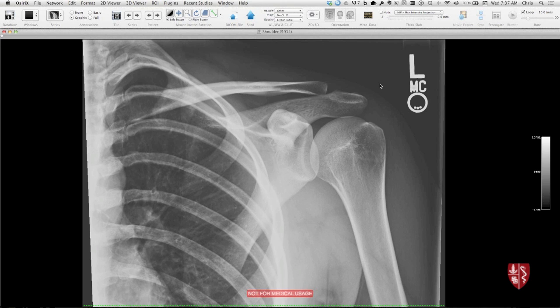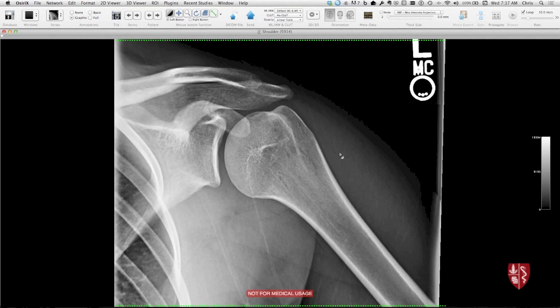And then as we go along I'll try to ask for some of the audience input. Just remember you have the scapula with the glenoid fossa, humeral head, clavicle, acromioclavicular joint, and then the acromion here. And this process that's coming out here is the coracoid. This would be just a straight AP view. And remember on the AP view you should have overlap between the humeral head and the glenoid if the glenohumeral joint is normally located.